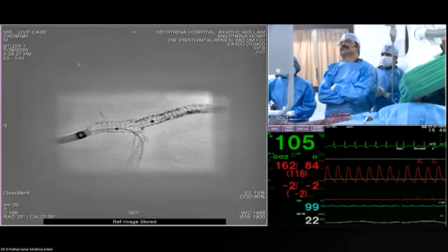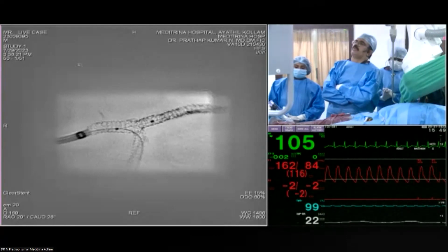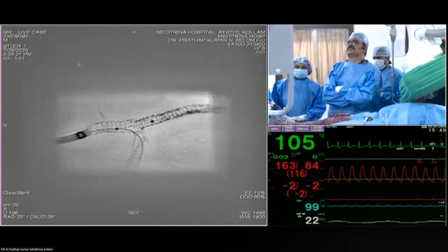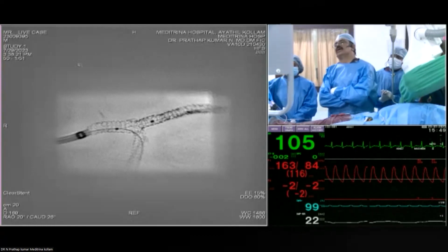There is a crush created, but the ostium, probably because of my high dilatation of the balloon, you should actually understand that we have done an initial cutting balloon with a 3 millimeter in the ostium for both the vessels and then did this case.